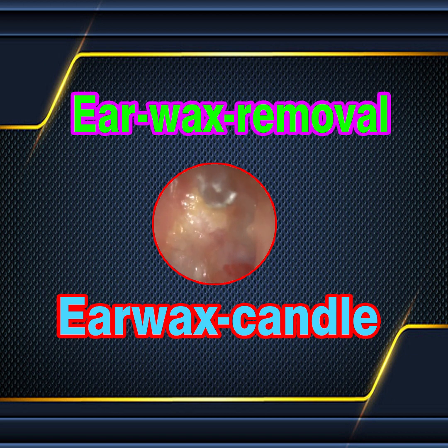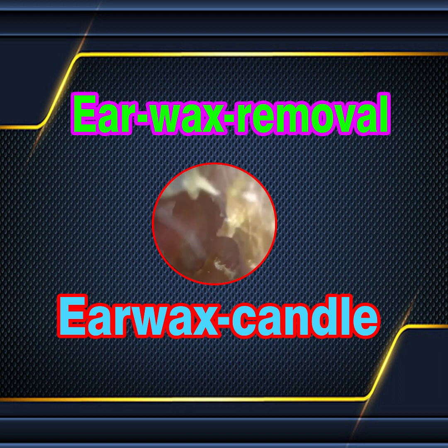And there's just some damp, dead skin on the posterior superior quadrant. So northwest part of the ear. I'm just trying to, again, peel downwards. I don't want to extend the suction probe any further. I don't want to dig into the eardrum. I want to come away and down, so gliding downwards to make minimal contact. I'm really, really pleased with that. There's another bit of skin just there. So in terms of the eardrum, I'm very pleased with that.